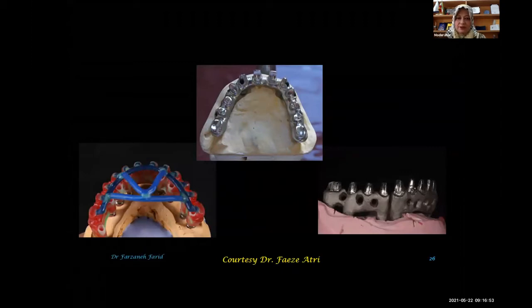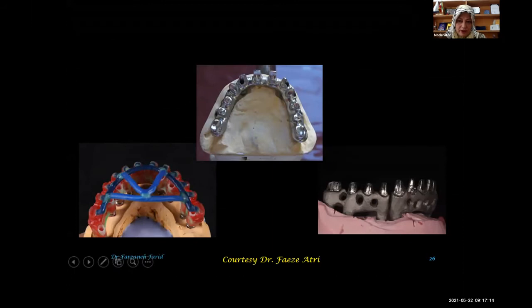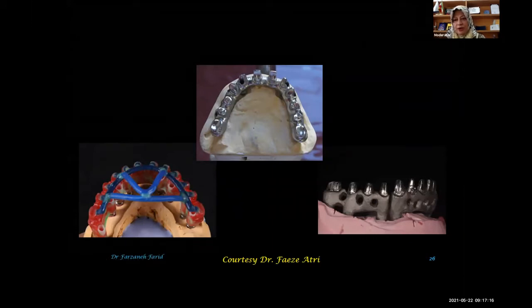Because if you have any problem with a screw attachment, with a wax up, or anything like that, you may not have a complete casting, and it would be very difficult to redo the castings. Here, as you see, it's very nice work, but with a conventional work.